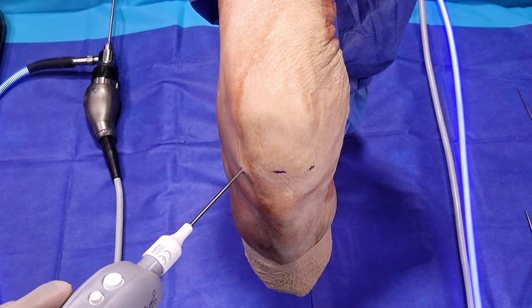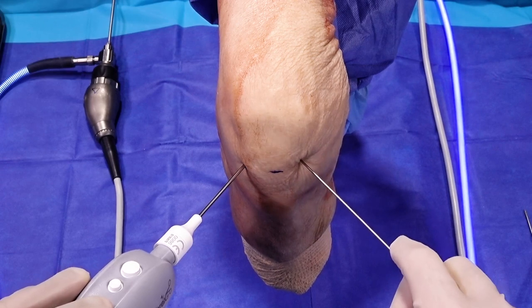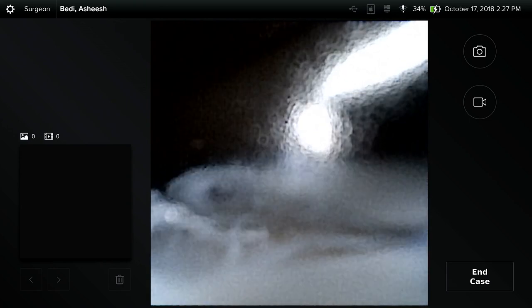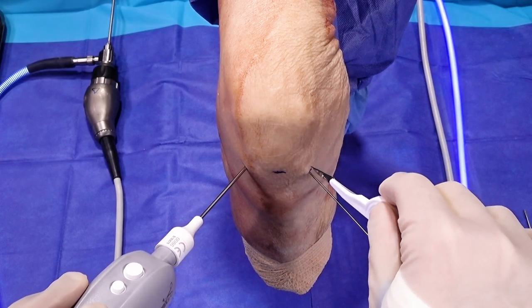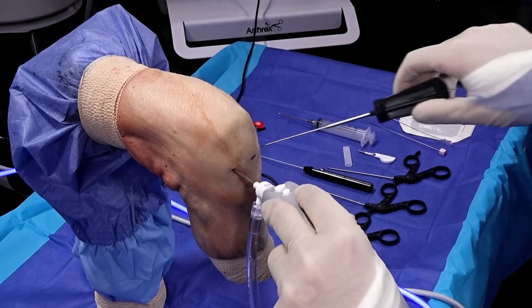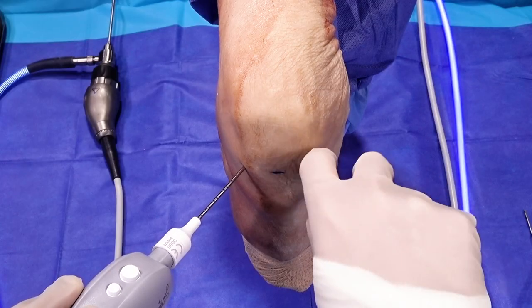The knee is just hanging at 90 degrees here. Now we'll place our second portal using a spinal needle coming in from the medial portal. The beauty of this is under direct vision we can watch the needle tip come into the knee joint. We're now inserting the guide wire via that spinal needle — we can directly triangulate that to our desired location — and then use the disposable 11 blade to gently nick the skin to allow placement of our working cannula.